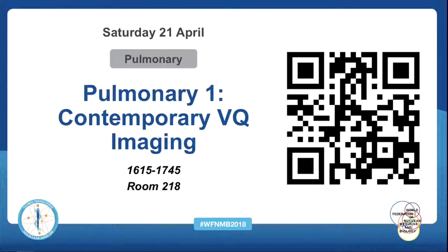Very, very rare that we would encounter that. But obviously there's always that option. And look, occasionally I guess you'll have a patient where you know that the only thing you're going to get is an anterior posterior planar, and that's better than nothing. And then you just have to qualify your result to say, look, there's no massive PE going on here. There might be some small subsegmental things that you're going to miss. But I have to say it's very, very rare that happens now.